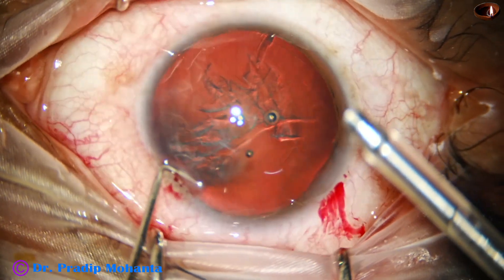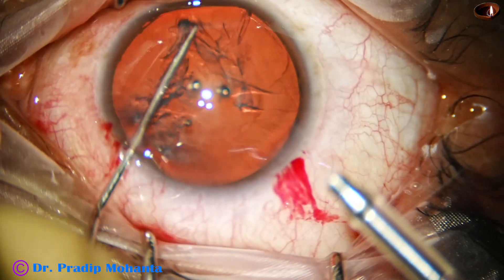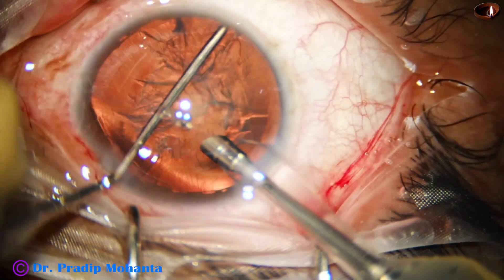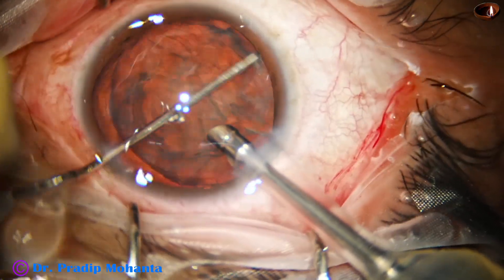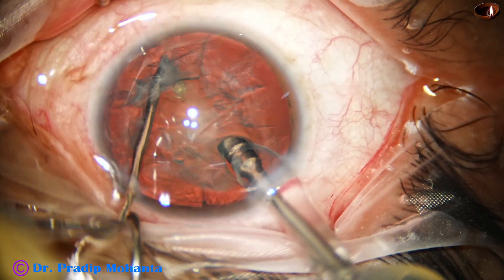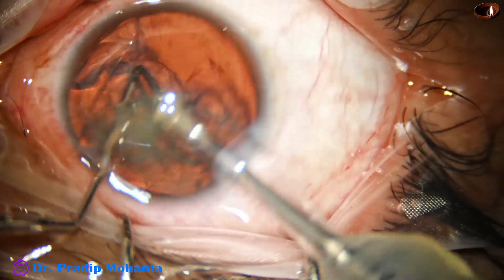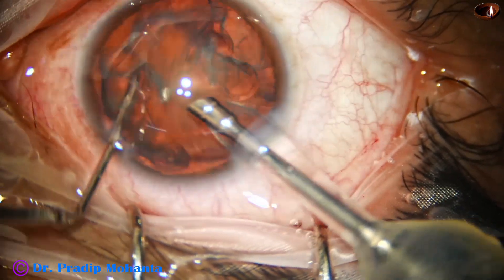This is a very long chopper and the idea is to go to the posterior surface of the lens and mechanically divide the nucleus. Now I am going to divide this nucleus. See the beauty of this long chopper — it has divided the nucleus into two hemi-nuclei and immediately I can aspirate the hemi-nucleus.